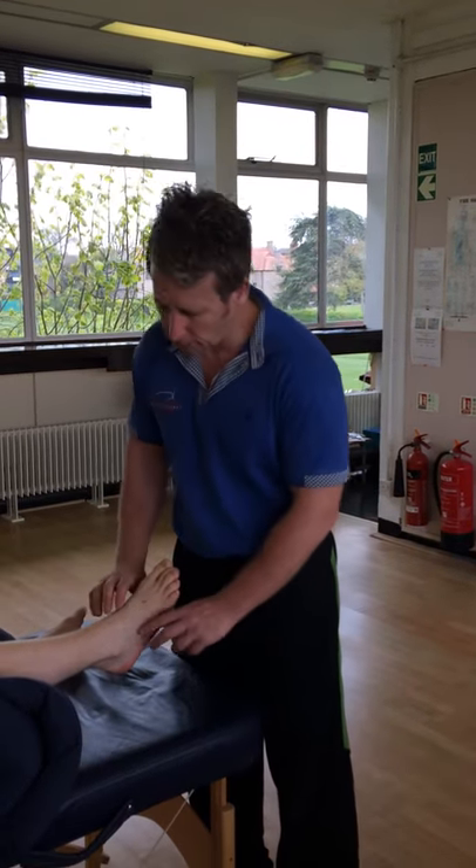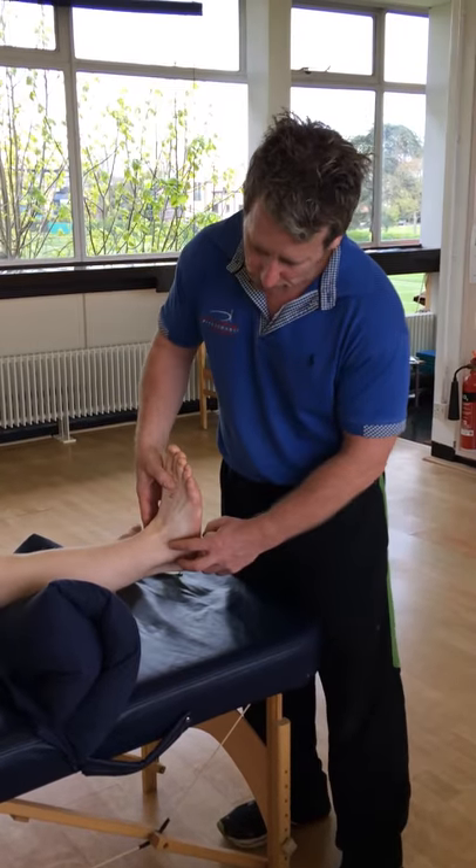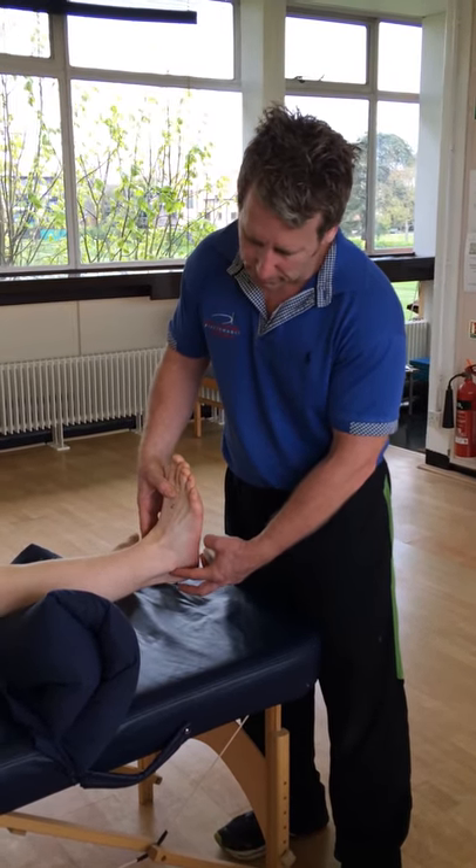First of all, we're going to keep the foot in a dorsi-everted position. We're going to stabilize the ATFL ligament and the CFL ligament.